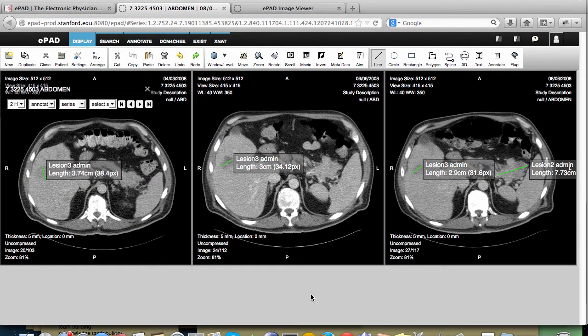Now consider the second task of evaluating quantitative features in images to better characterize disease. Many people are creating software modules that calculate a variety of quantitative features in images like texture and shape. We built the EPAD platform so you can extend it with your own algorithms and applications. We have a web service layer which gives your developers access to the EPAD data model. Your applications can read and write images, annotations, users, and projects. You can create your own client or server-side code on the EPAD platform and run it as a plug-in. Researchers here at Stanford are working on new image processing algorithms, so we built our platform to use them as decision support for the radiologist. The lesion summary table is an example of a client-side plug-in.